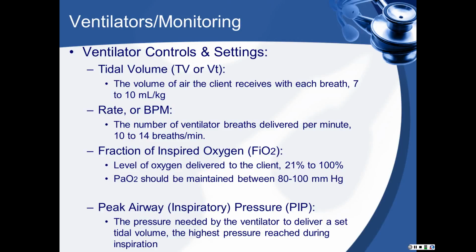Your tidal volume is going to be set to deliver 7 to 10 milliliters per kilogram with each breath, and that is of air. Your rate is the number of ventilator breaths that will be delivered to your client per minute. It's usually 10 to 14. Your FiO2 is a fraction of inspired oxygen. It is the level of oxygen that we will deliver to the client with the ventilator, and it's going to be between 21 and 100%.